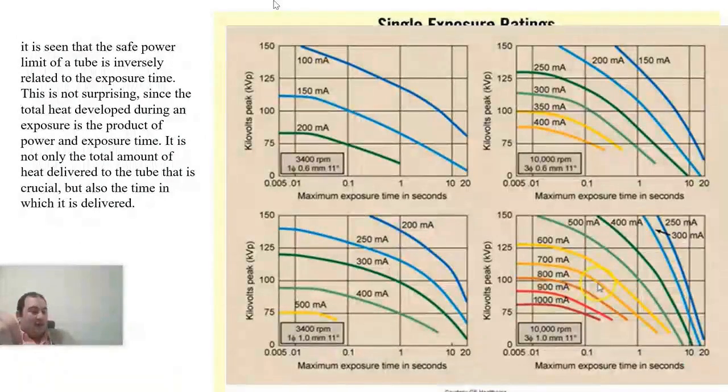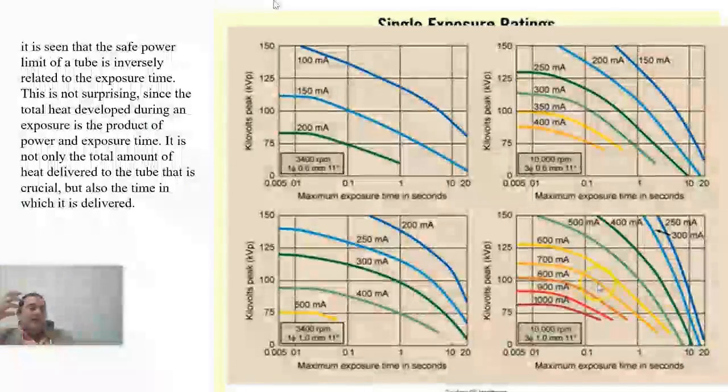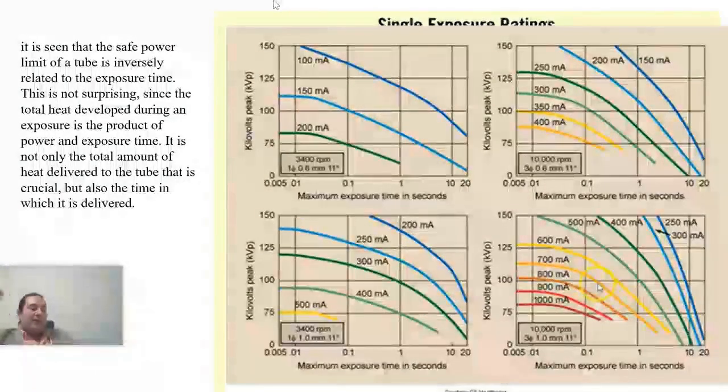Now, if I talk about the CT machine, if you perform a detailed cardiac examination procedure, like the intricate and complex cardiac angiography procedure, which involves detailed imaging, you are dealing with an 8 mega heat unit tube. The technical engineer or specialist responsible for the operation and maintenance of the machine won't discuss this with you. He won't mention the comprehensive tube rating chart, which provides detailed specifications. I want to tell you that if you request this specific information from him, he will likely not provide it.